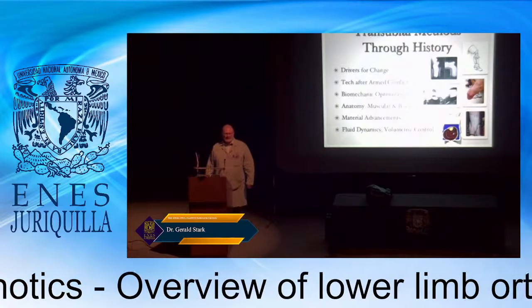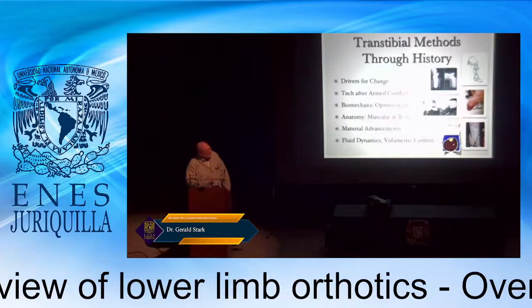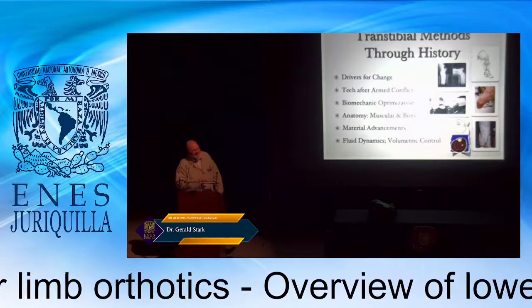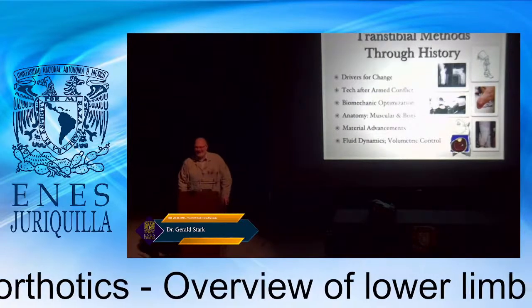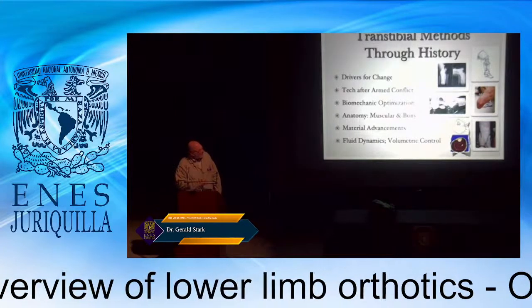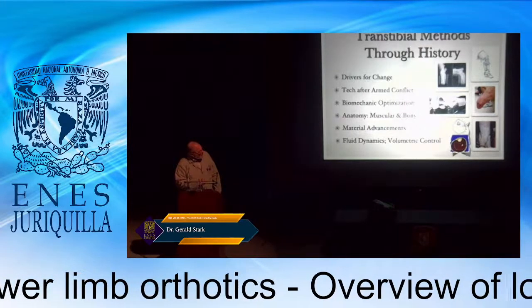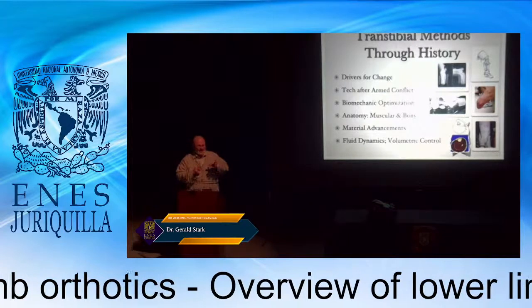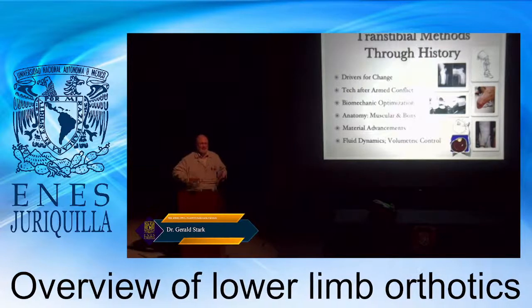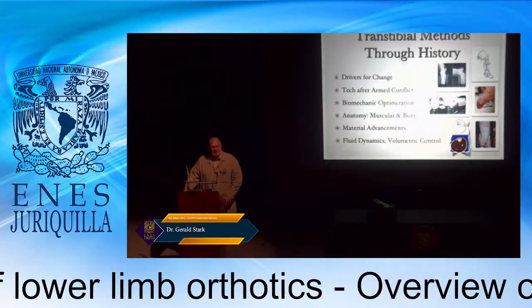And you might say to yourself, that's very ancient, but if we use a BOA system here, if we use carbon uprights, and then we use Kevlar reinforced plastic, we would make it the same way in the year 2021. And they had certain advantages with volumetric change. But the other thing is this is showing you what a wooden socket felt like. Some people were very good at crafting these. Older prosthetists will often talk about making a wooden socket, and they'll say they were much better, but they really were not.